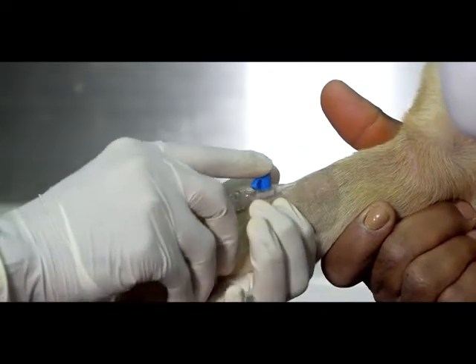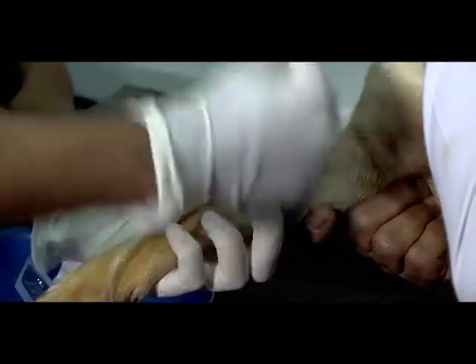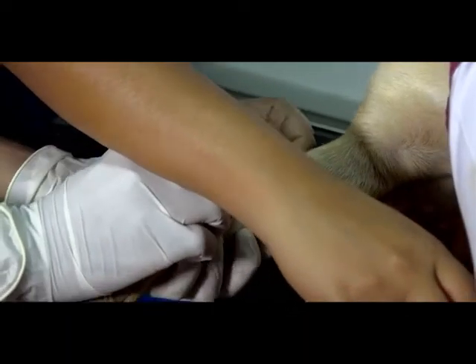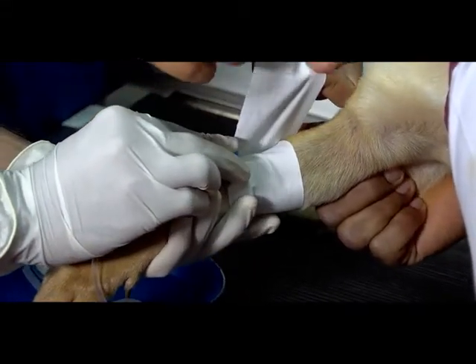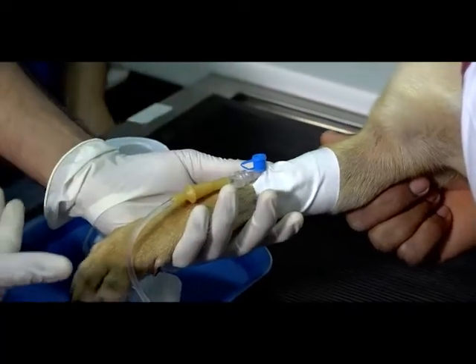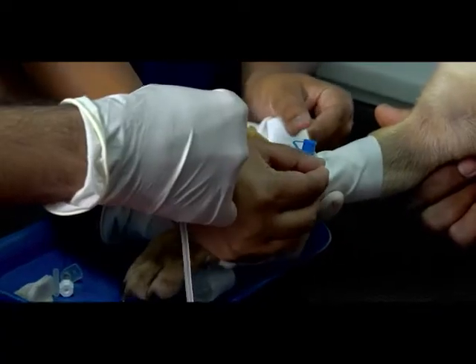You can slowly place the plasters. So we're going to apply the plaster. Well, first plaster should go over the plastic part of the cannula. So we're going to place the plaster first, like this, and it should go over the distal part of the forearm like this, around the hand. You should be very gentle, and the plaster should have a firm grasp on the cannula. And there's another plaster that we would be applying underneath this part of the cannula. Just gently lift this up and take the plaster forward as much as possible.